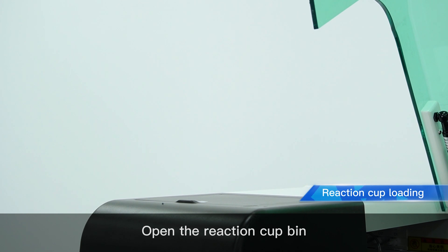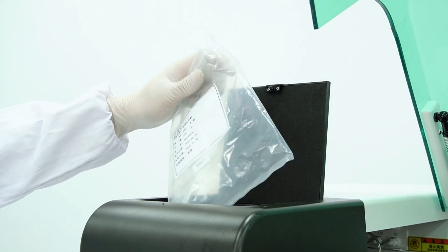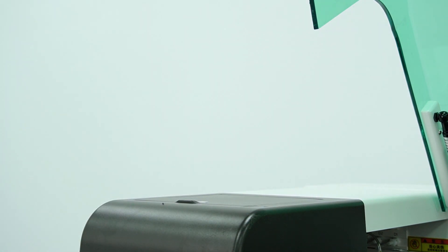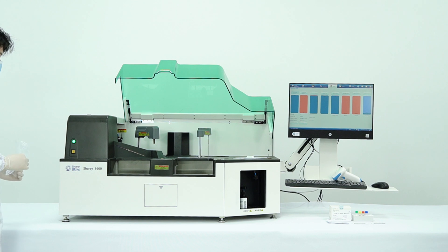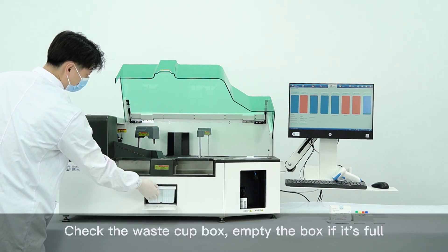Open the reaction cup bin and add a certain quantity of reaction cups. Check the waste cup box and empty the box if it's full.